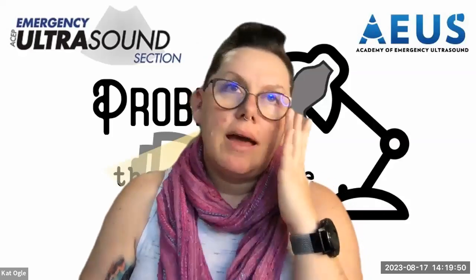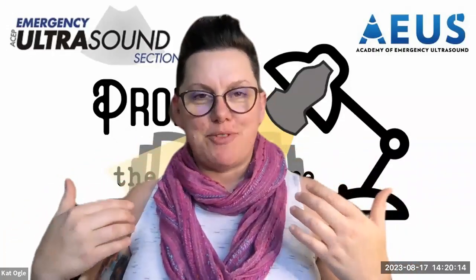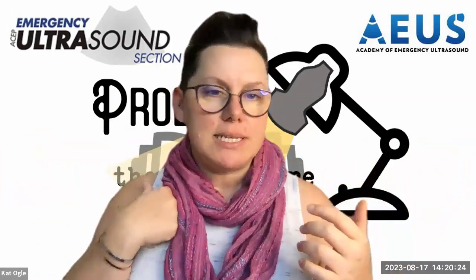Yeah, so I think we have to be very careful, and it comes back to teaching. If we simultaneously reviewed the trauma film from that video, we would see that some of these residents had the probe up by the clavicle when doing a supine assessment for a pneumothorax. And really, when you're doing a supine assessment for pneumothorax, your probe needs to be at the highest level of the chest. That's problem number one, which we can't tell just by looking at ultrasound images, unless you can literally see the clavicle there.